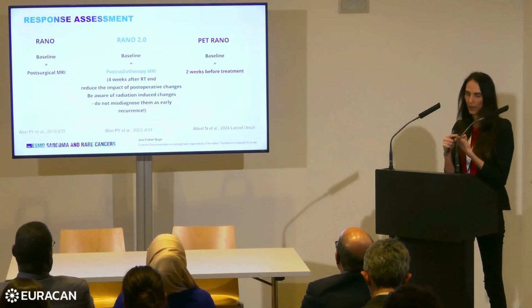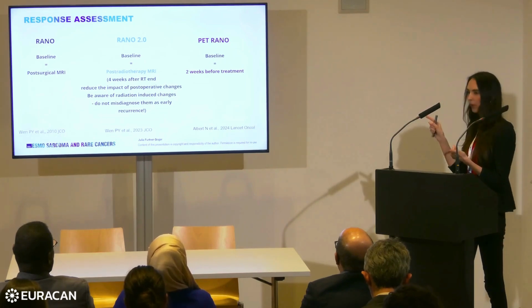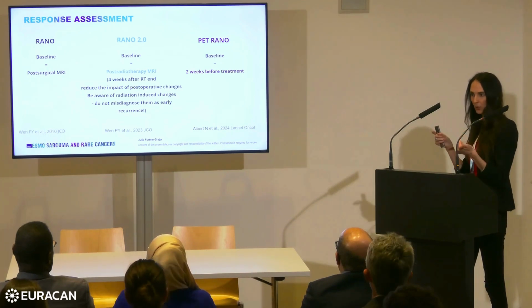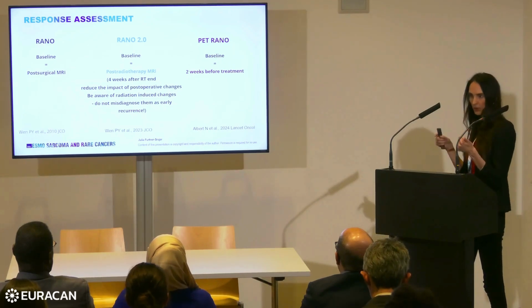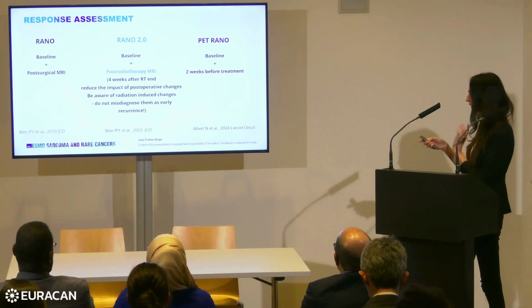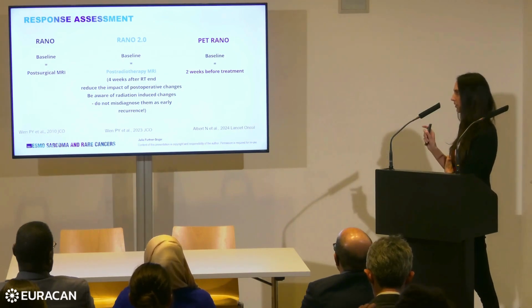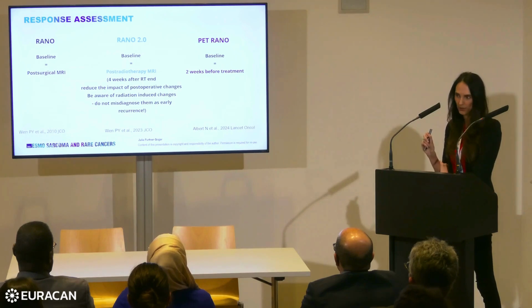But be aware that this imaging time point is established in your institution, because we conducted a pan-national study in Austria, and we found out that no center did MRIs at this specific time point. And the second one is, be aware of the radiation-induced changes and do not misdiagnose them as early recurrence.